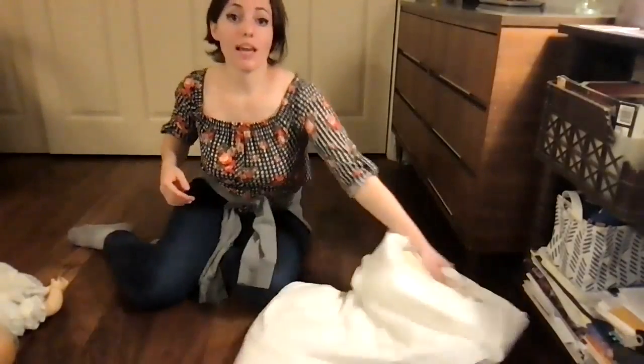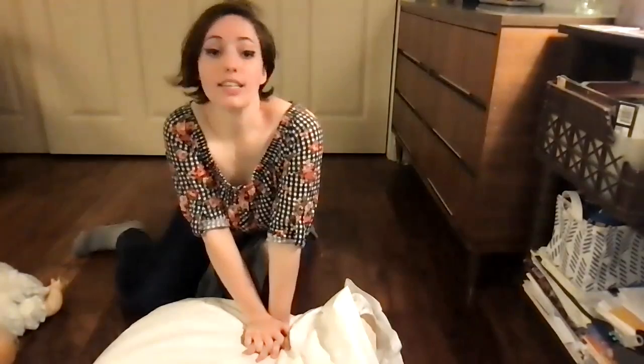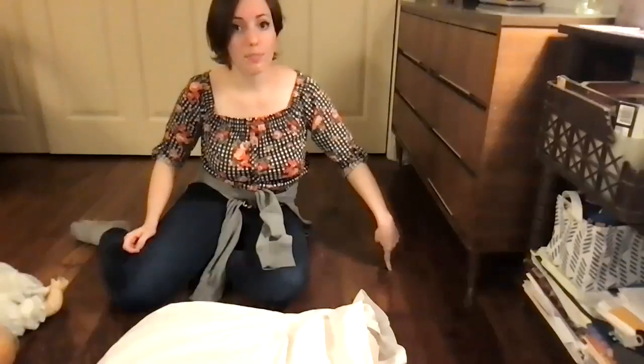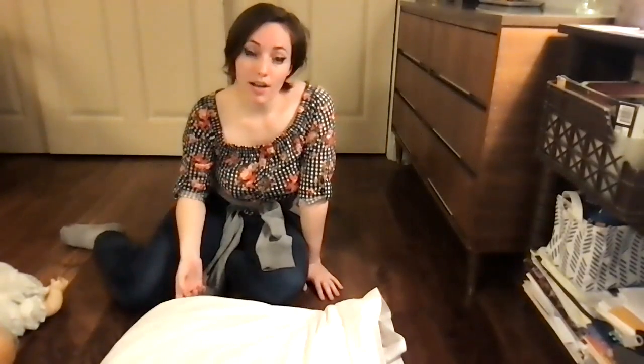When it says don't touch the patient, analyzing, don't touch the patient, make sure nobody else is. After it says shock advised or shock not advised, you can go back to compressions until it says shock ready to be administered. In that case, you're gonna stop touching the patient, make sure you're clear and everybody else is clear, then press the button that gives the shock. Shock administered, go back to CPR. You're just gonna keep doing this until EMS arrives.